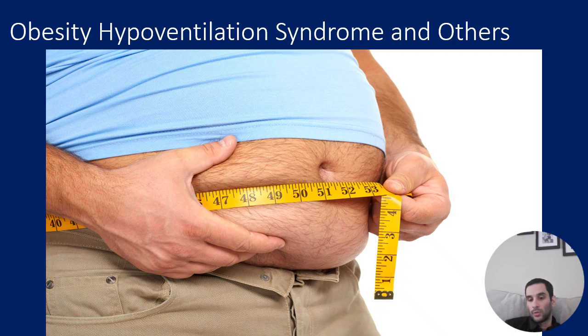And there are more, and we can't talk about all of them today, but one of the other ones where it can really matter is obesity hypoventilation syndrome, which is where the weight of the chest is so much that they actually get a little hypoventilation. So CPAP can really help with that. Non-invasive can really help with that.